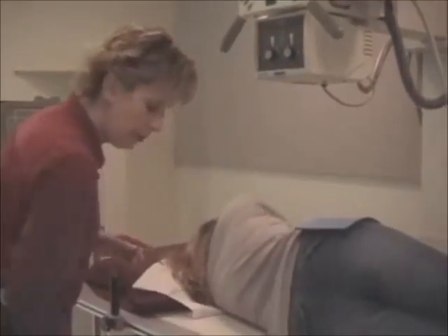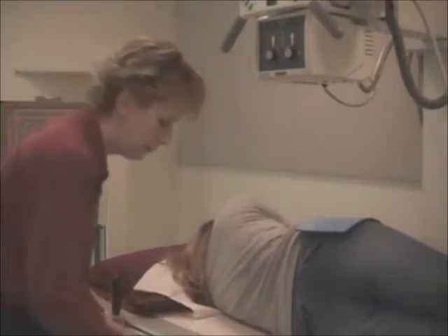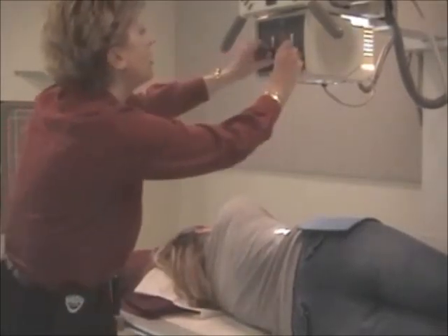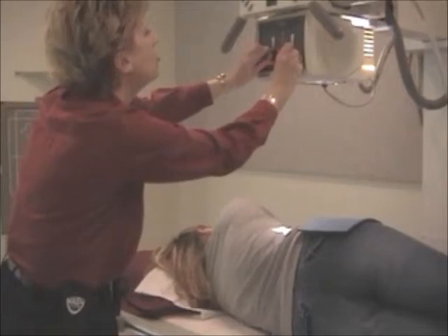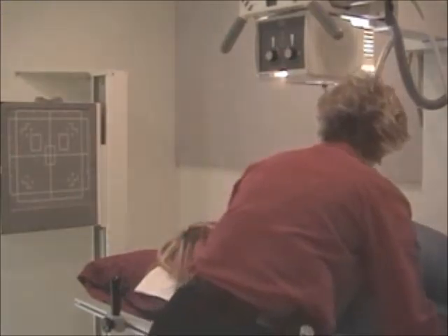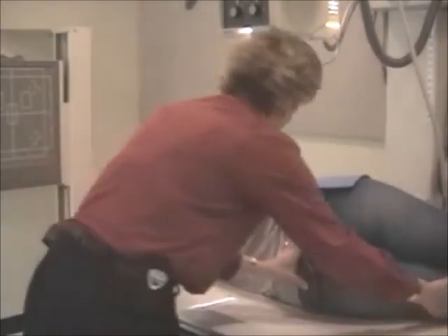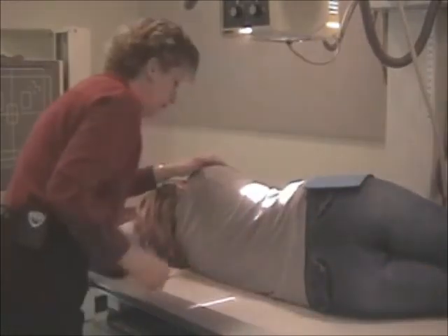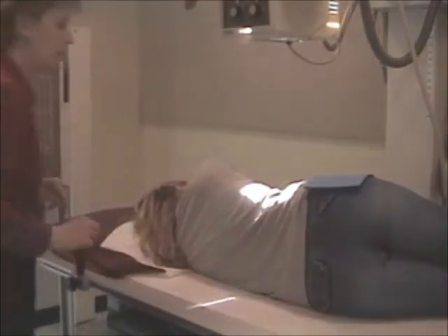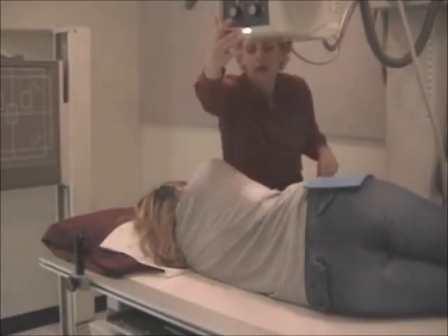And if you remember, when a patient is in a lateral or an oblique position, the stomach tends to elongate. So we're going to go 10 by 12 lengthwise. Adjust the collimation back to a 10 by 12 field size. We're going to straighten our patient up so they're straight on the table and they're in a lateral position. If the patient was squirming on you or uncomfortable, go ahead and put a sponge between their knees. That will make them more comfortable. And I'll work from this side of the table.